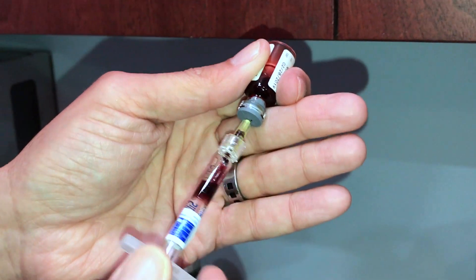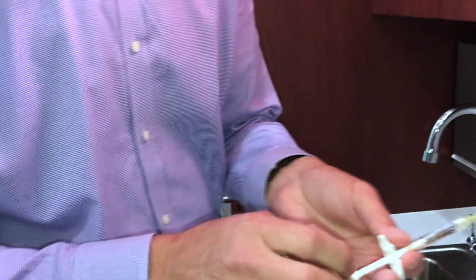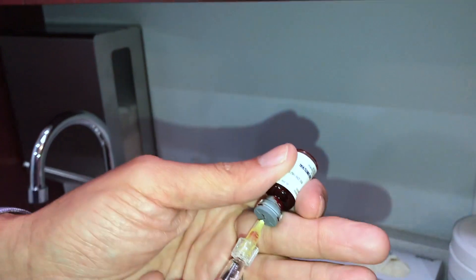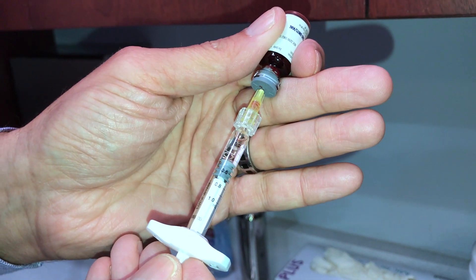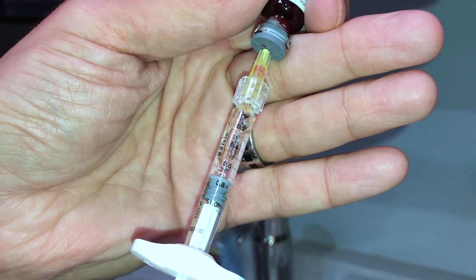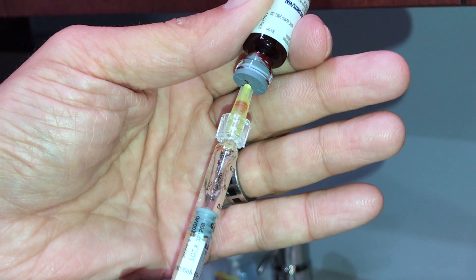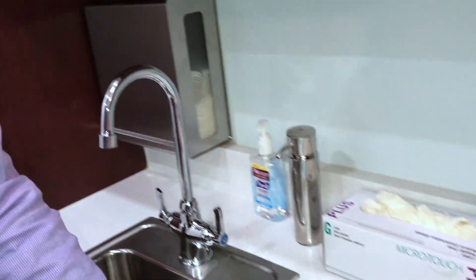There was a Dr. Carey and Dr. Susan Winkle who did a study that said aspiration didn't work. I was trying to redo their study to see if it worked or not, and I've actually debunked their study. However, I didn't dilute this with anything, and you can see that aspiration doesn't work very well with Belotero. So with all the Restylane Galderma products it did work, but it does not work with Belotero.